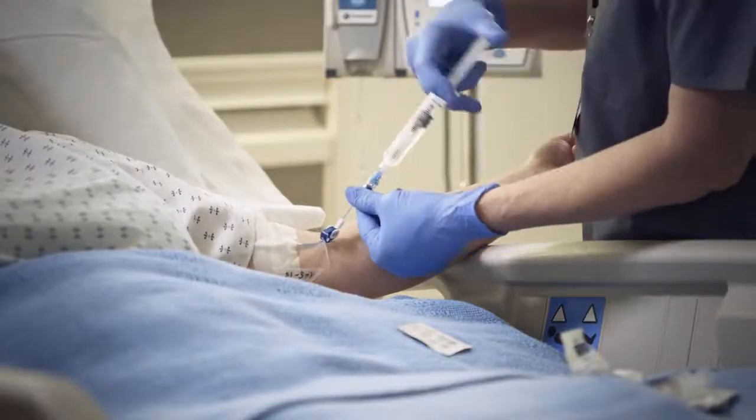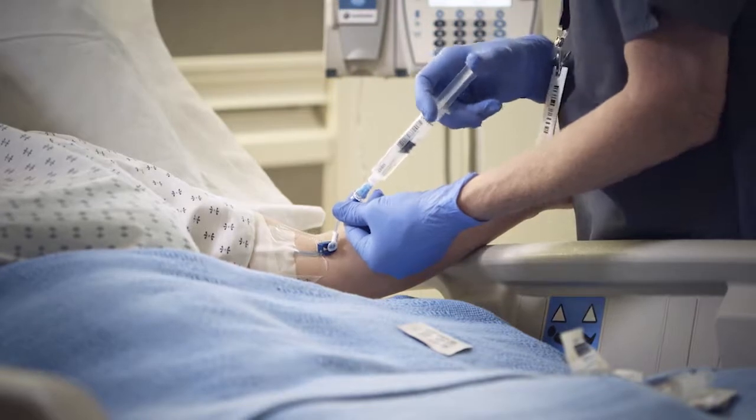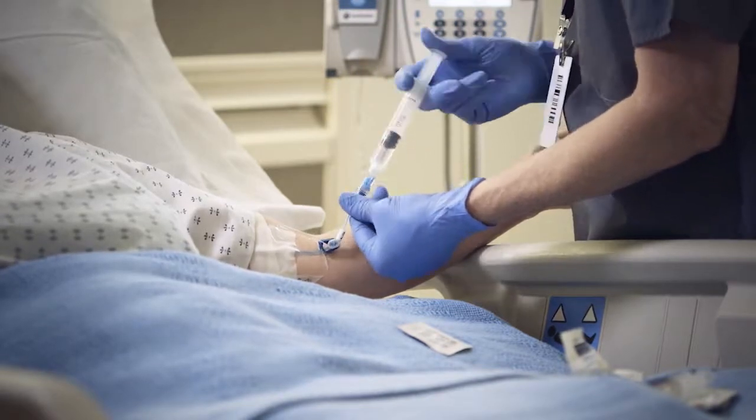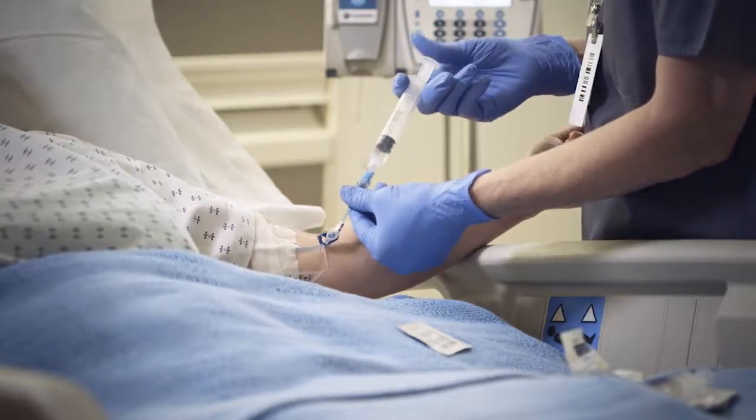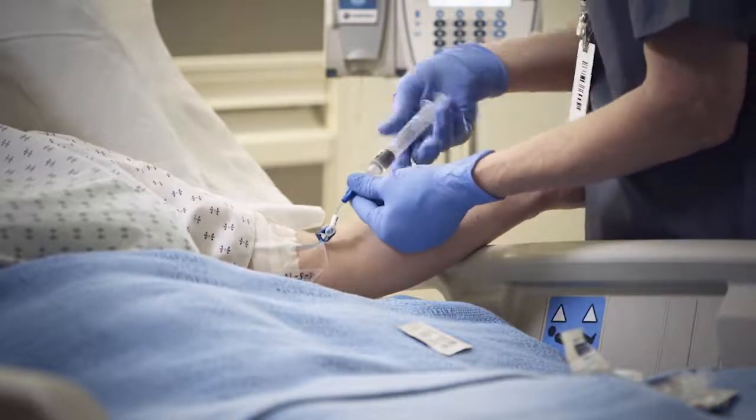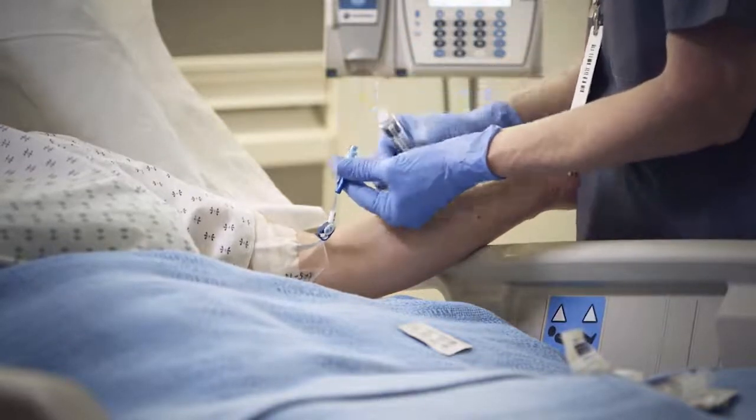Adequate flushing of the needle-free connector and catheter is important for catheter patency and dwell time. According to INS standards of practice, after a blood draw, you should flush with 10 milliliters of saline and lock with an additional 10 milliliters of fluid. Check INS guidelines.